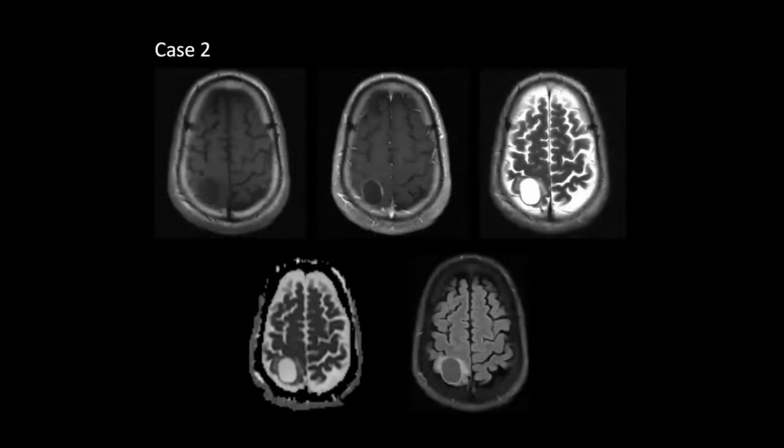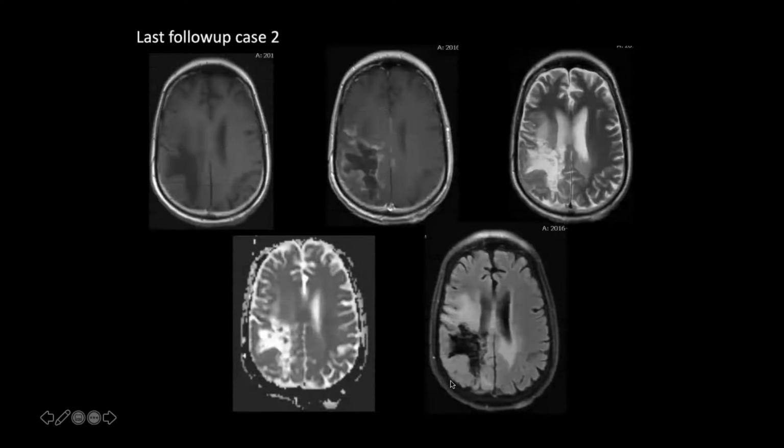This is the second case. We can see again that this GBM with PNET features looks very much like the previous GBM, but it doesn't look like the GBM without PNET features that we saw at the beginning of the presentation. It is big, but the morphology is very similar, and there is again infiltration here. So also in this case, we have recurrence of the tumor here. This is post-treatment changes, but we still have recurrence of the tumor because we couldn't basically remove the entire lesion.